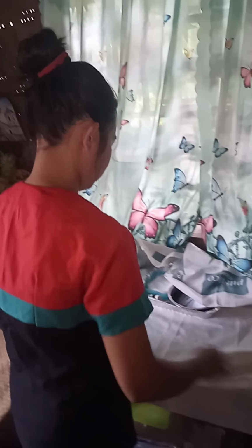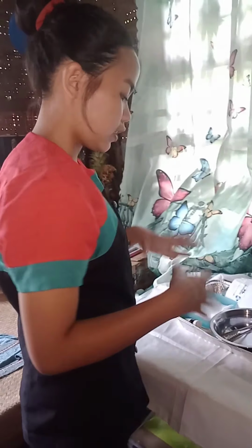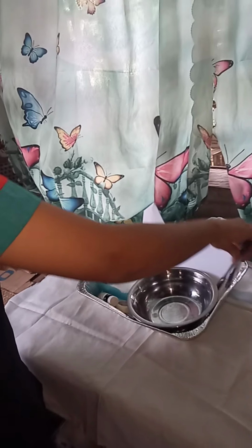So we need to prepare our equipment. We need to maintain the sterility. Then, it is the time to pour the bottle of solution into the sterile container in the sterile basin, as you can see here.